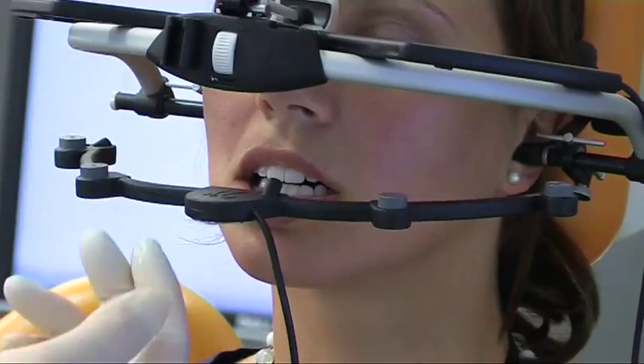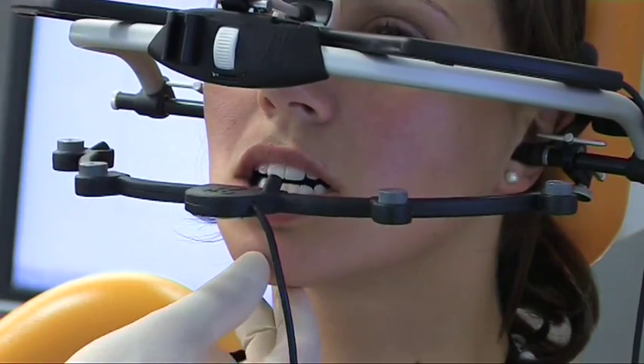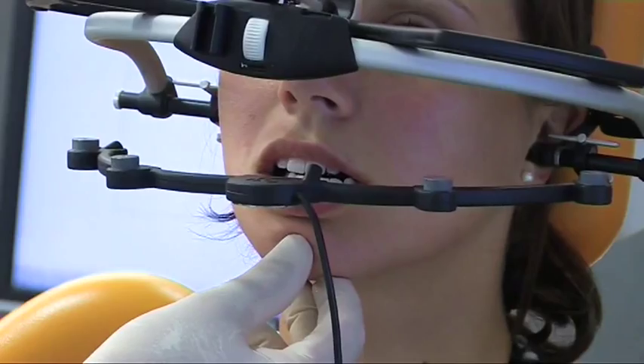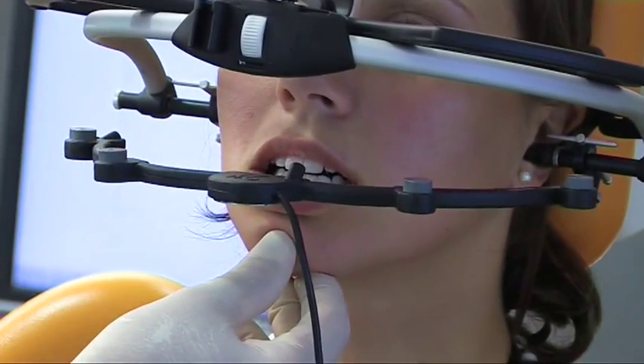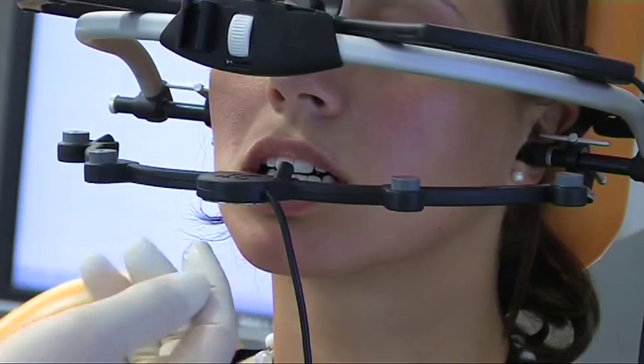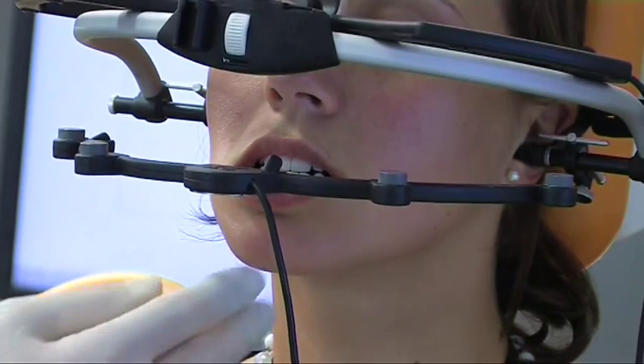The support pin is set to a height so that free movement is possible in both the protrusive and laterotrusive directions without tooth contact. Now close and move the lower jaw forward and then back.